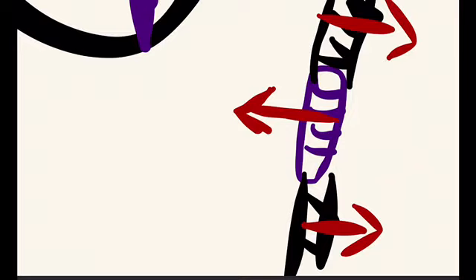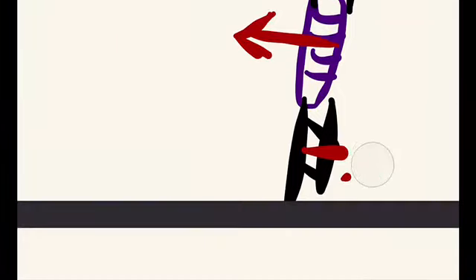Now in the repolarized state, when there is no depolarization, there is no wave from the normal tissue. But this abnormal tissue is still depolarizing in the wrong, opposite direction.